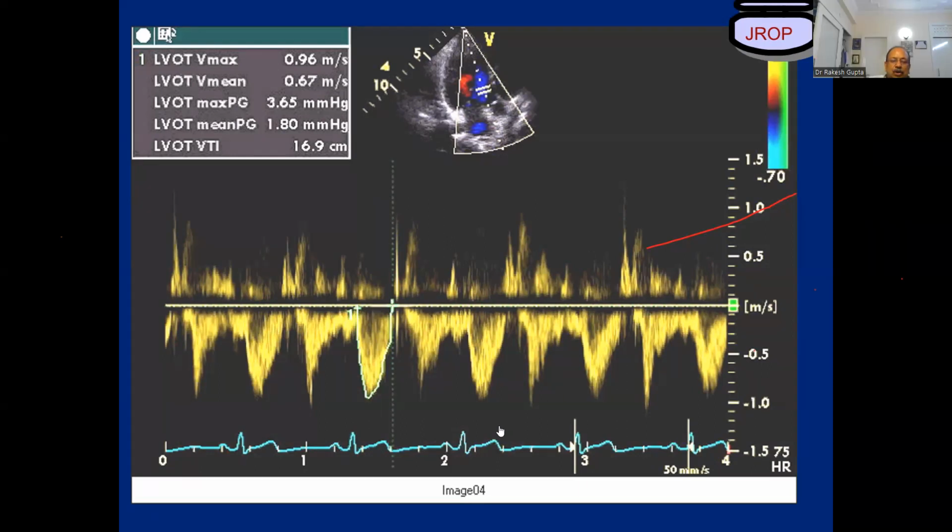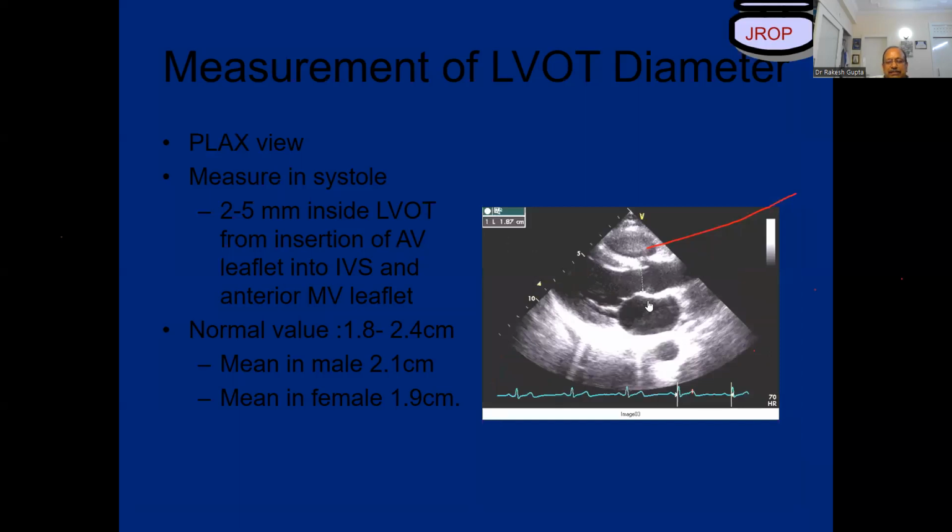2D image gains. Look, if you look carefully in this image, this cavity has nothing, no structure in this cavity. Yes. But it's still showing some white speckles in this cavity. More over here. So it means its 2D gains are high. So we try to reduce the 2D gains so that we see a black cavity over here and a white interface over here. Okay. So this is over gains.